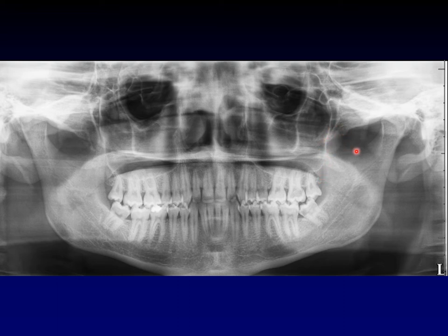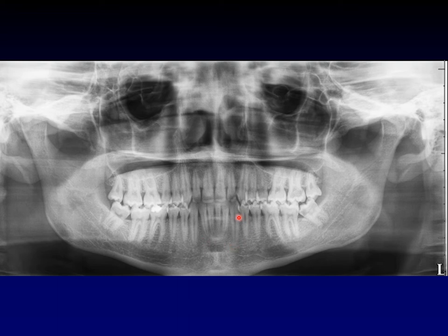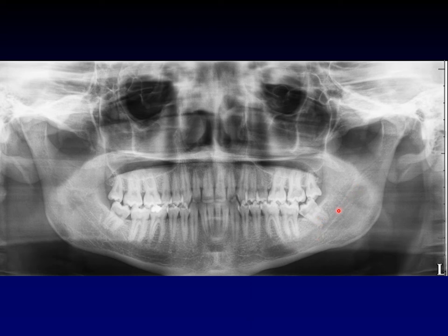You have a coronoid process so that your temporalis muscle has something to attach to. When we're right here in the middle of the jaw, nominally between the canine teeth, this is called the symphysis, or the parasymphyseal region of the jaw. If you look carefully, you can see two parallel sclerotic lines running from the ramus down into the body of the mandible. Those are two edges of a canal running through the mandible — the inferior alveolar canal.